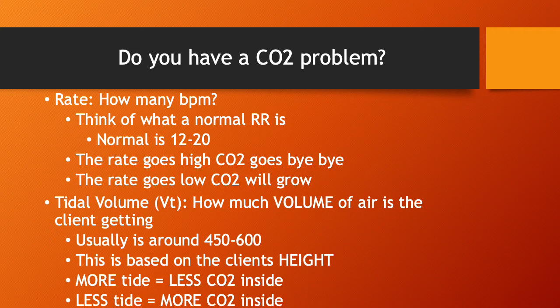If you think of it, that makes sense because that's what a normal respiratory rate is for a normal person. And the thing to know as the nurse, I don't need to go in and be able to say, oh, a patient needs to be on a rate of 14 or something like that. But I just need to compare what their rate is to my ABG. And, if there's something abnormal about my carbon dioxide, then I can use that rate. I can go up or I can go down based on what their CO2 is.